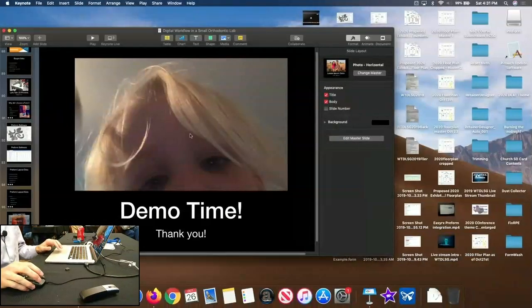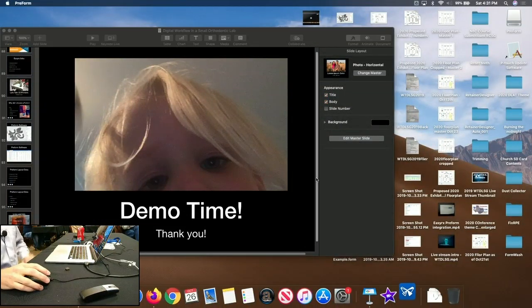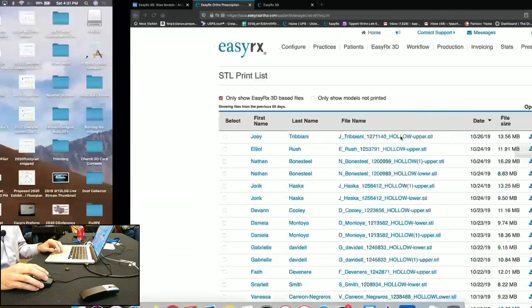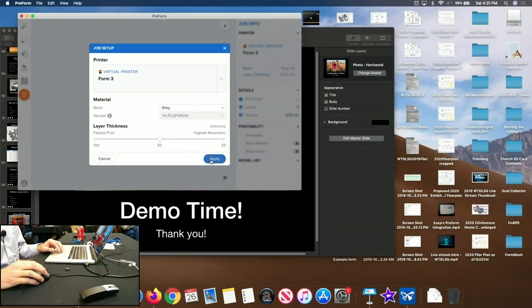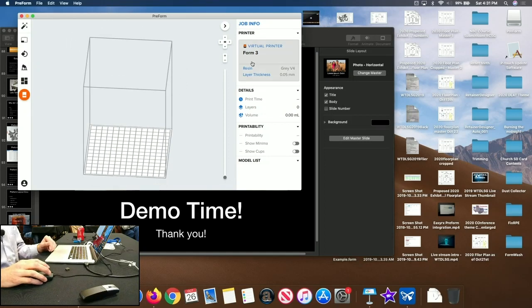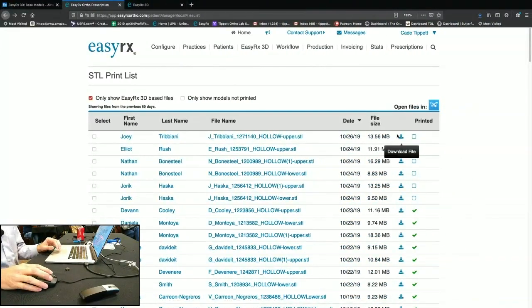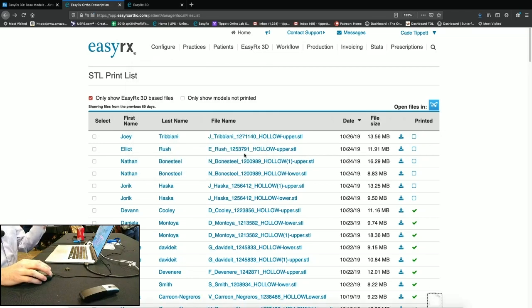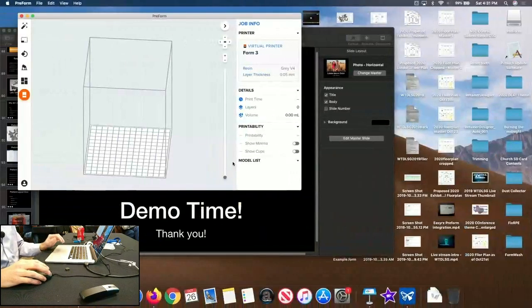So let's see if I can open up. Let's say I don't have that, and apply. So this is my Preform software, ready to go. It's using a fake virtual printer. I can go back to here and download it. So you can download your files at any time. You don't have to, especially if you're using a PC, because it'll go straight from the EasyRx servers to your Formlab without ever being downloaded to your computer.